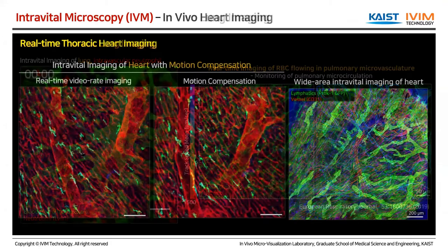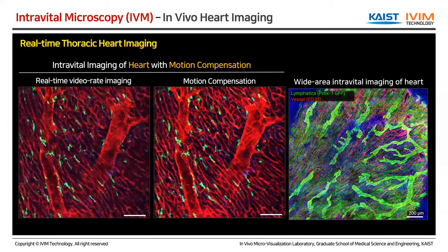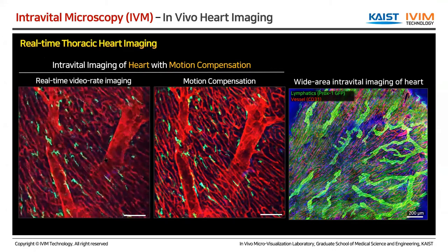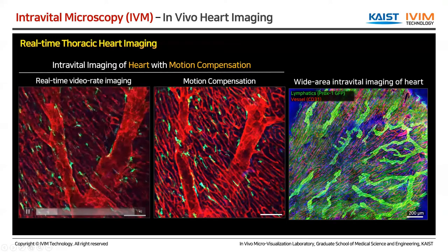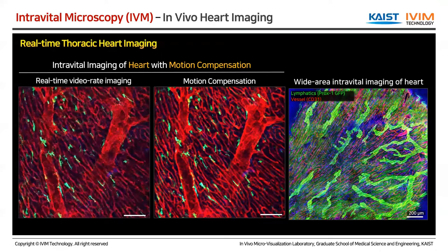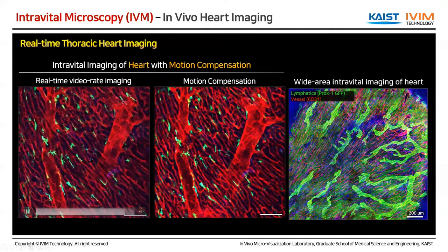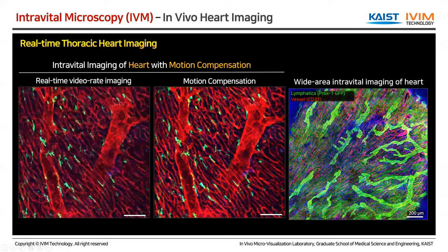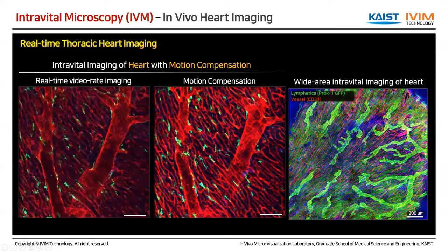And then we can also use other stabilization window devices for heart imaging as well. So actually this was heart imaging, a real-time video obtained from the heart. The heart is already beating, so we use the same principle to stabilize the motion of the heart in a very small area. And then even after the stabilization, we still have this huge motion artifact. So we definitely need motion compensation functions to observe the single cell movement inside the heart.